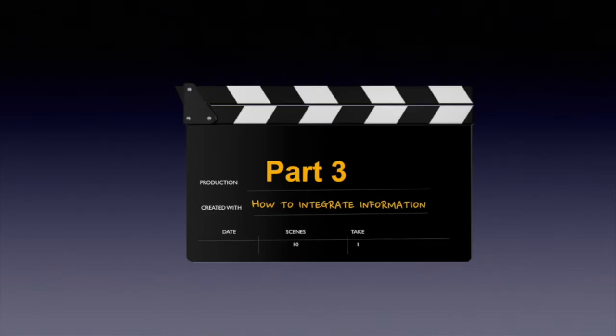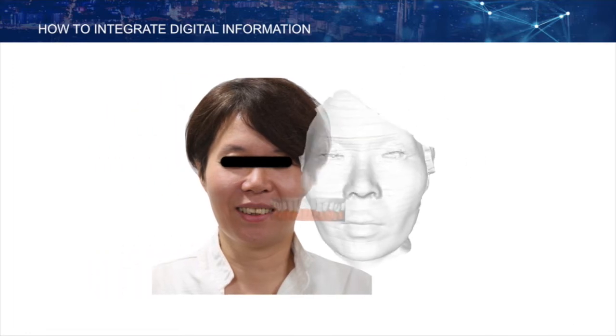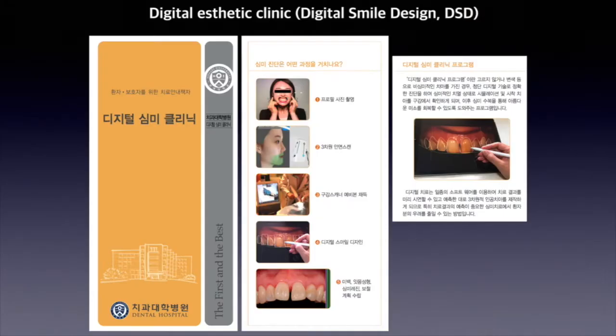Next, I would like to talk about how to integrate various digital information: profile photo, intraoral scan, and 3D facial scan. Even if I use each material alone, it helps me a lot. But when they are joined together in accurate alignment, they exert tremendous power. With the patient's face information, the design for aesthetic treatment becomes intuitive and easy.